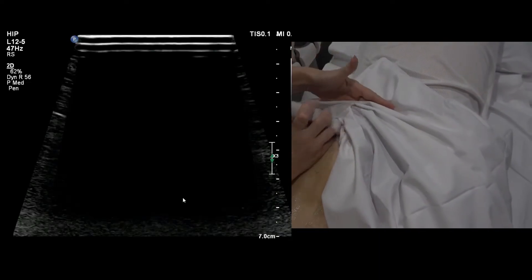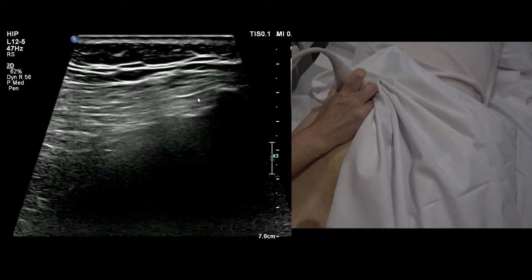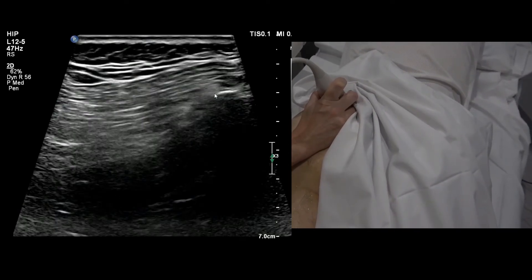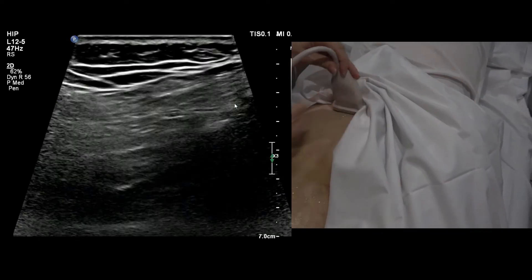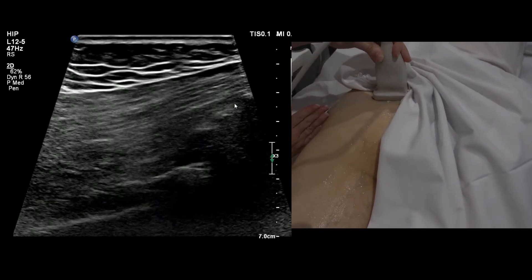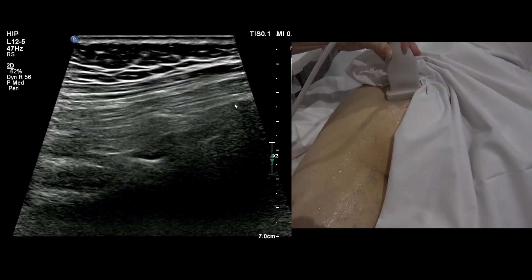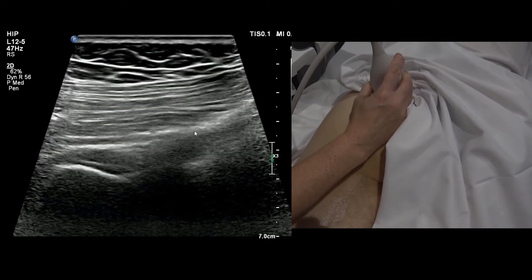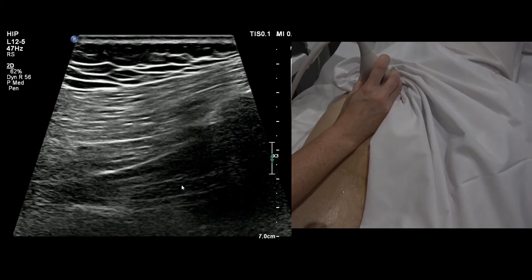The best way to find piriformis is to start at the very top, just below the sacroiliac joint, at that bony lump, then drop down until the bone disappears and angle the probe to point at the greater trochanter. About a centimetre below the PSIS, you'll fall on piriformis. You'll see glute max, come a centimetre below, go back up — that's piriformis from there to there.